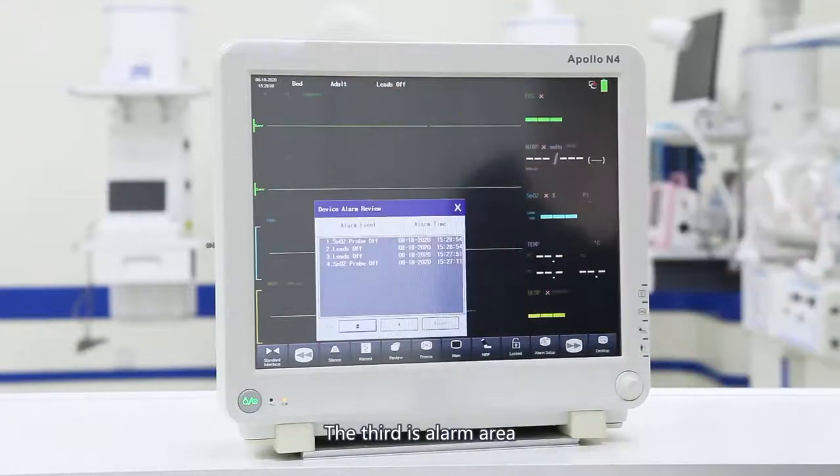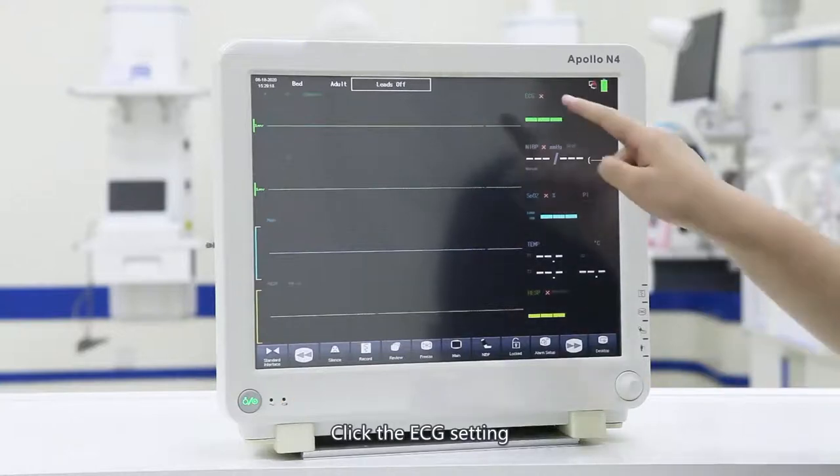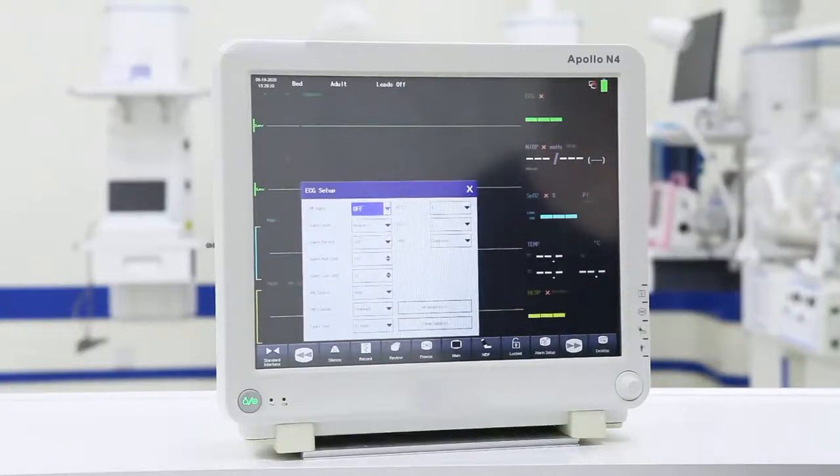The third is the alarm area. Click it to display the alarm event as well as the name and time. Click the ECG setting in the upper right corner. You can set the alarm switch, alarm level, alarm record, alarm upper and lower limits, and the source of heart rate, which can be obtained from ECG or blood oxygen probe.